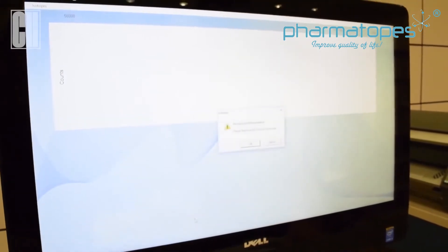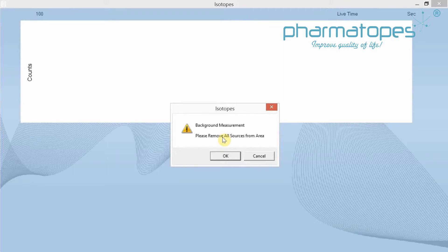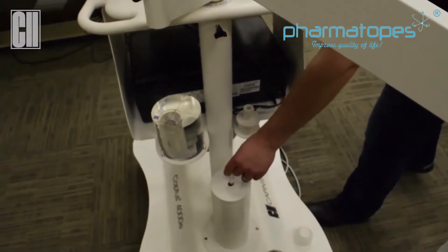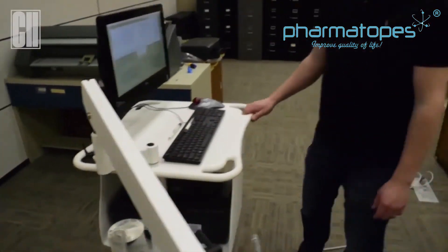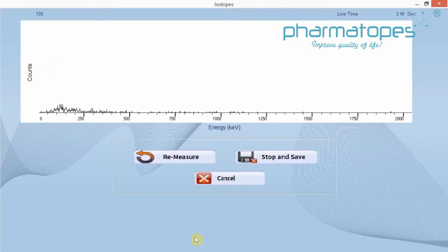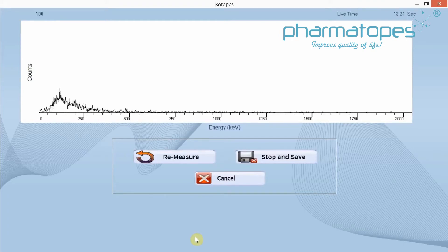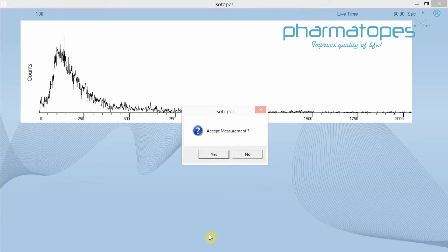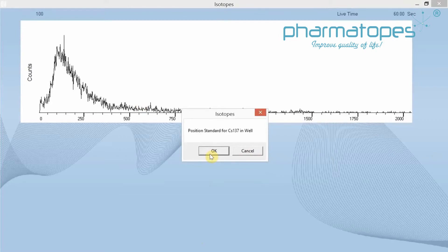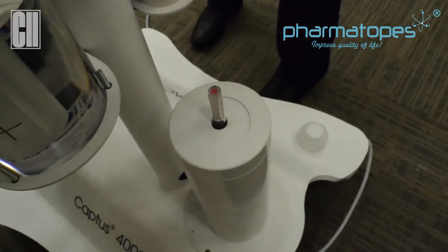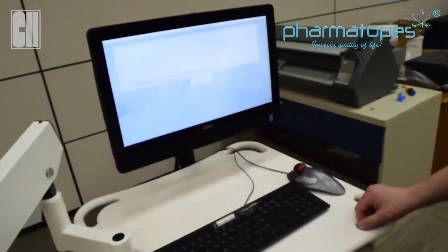Once we click on Start Procedure, it's going to tell us to do the background — please remove all sources from the area. We're going to remove our test source and click OK. It's going to count the live time for 60 seconds at the top corner, and that will measure background, then we'll go to the next step. Once the background's finished counting, click yes to accept the background, and now we're going to position our cesium source in the well. Get the source with the black tip down and place it into the well. Once in place, click OK.